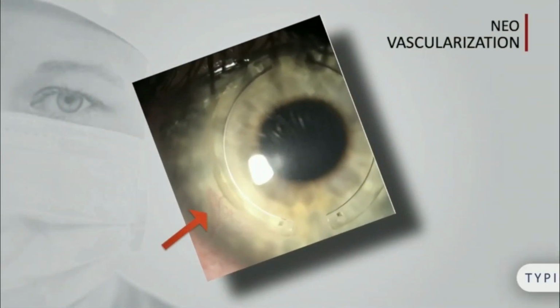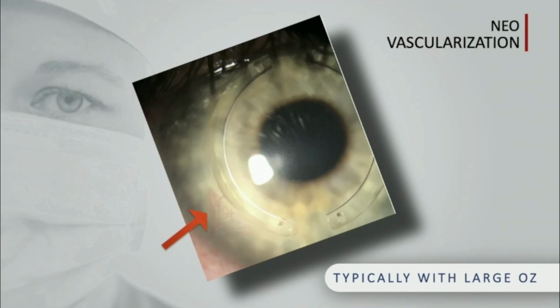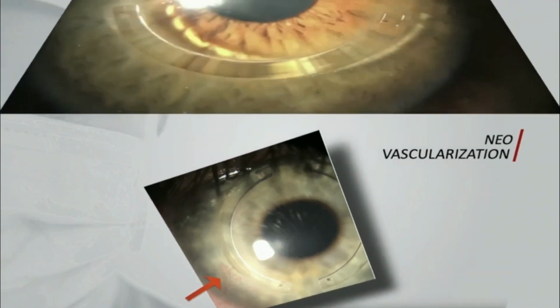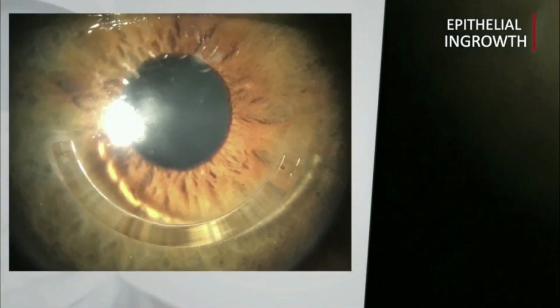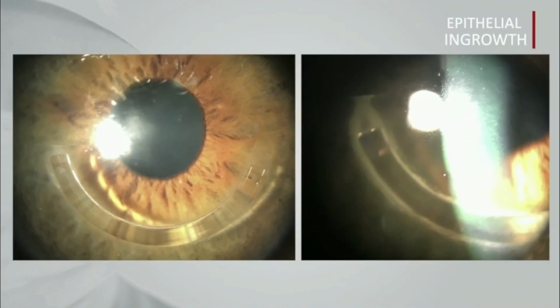Another complication is neovessels. In these cases, you definitely have to remove the ring earlier because you don't want to jeopardize the possibility of a future corneal graft. Here, you guessed it, it's epithelial ingrowth. That's very nasty. You need to remove it as soon as possible. Otherwise, you will have a diffuse melt at that site.